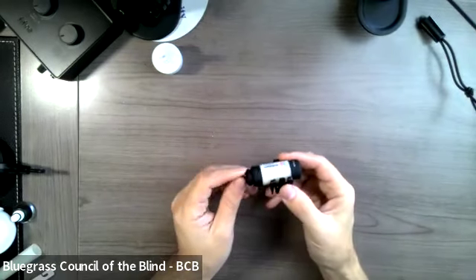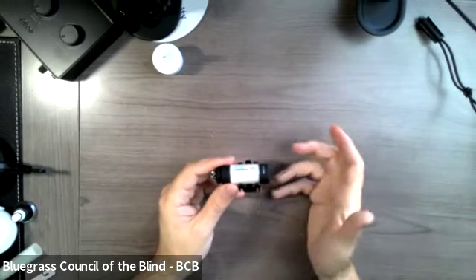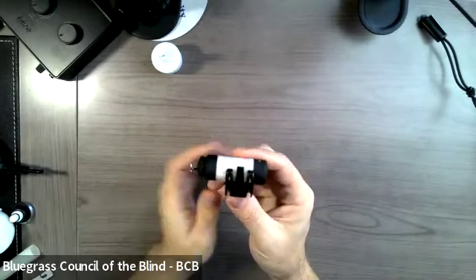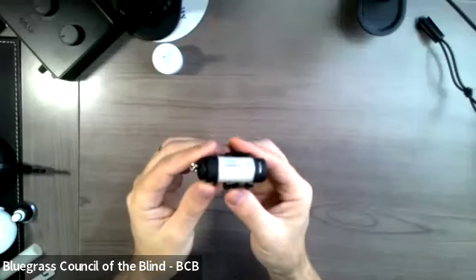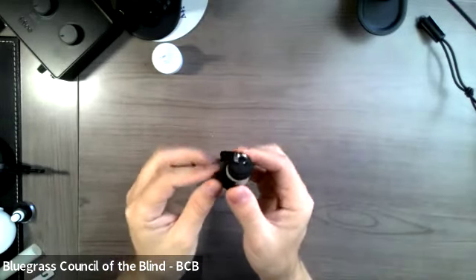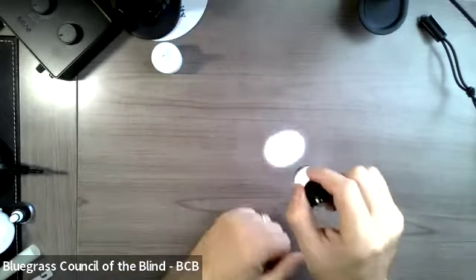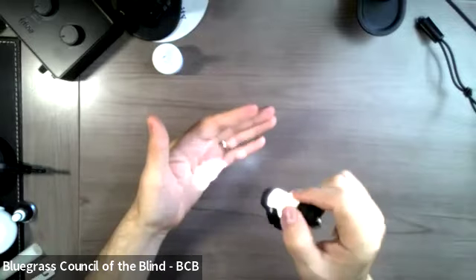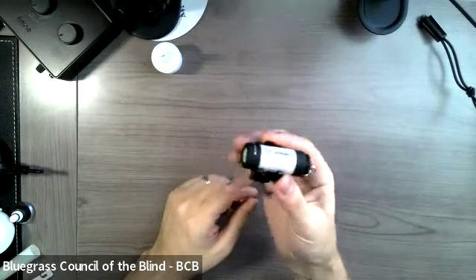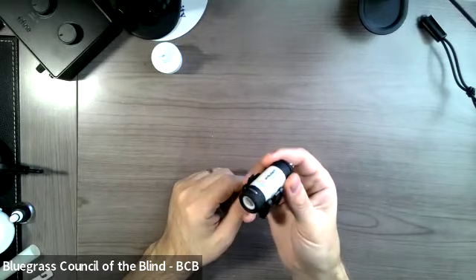Another accessory that I want to talk about, Ambutech offers lots of different accessories, including cane pouches, cane holsters, things like that. But you can also get this. This is the Pharaoh's, kind of like the Egyptian pharaohs, cane light. This is just a simple little LED flashlight that will clip onto your cane. It comes with little adapters that clip onto the cane, and then the Pharaoh's light will clip into the adapter. I can twist the end here and it turns on the flashlight. You can see the flashlight on my desk and my hand. This points down to where your tip is, and it just adds a little bit of light to where the end of your cane is going. So, pretty interesting. The Pharaoh's cane light.